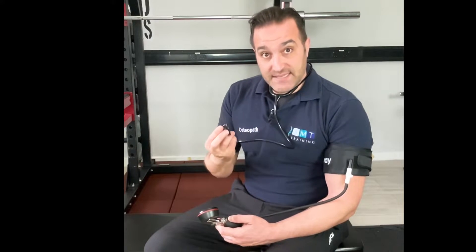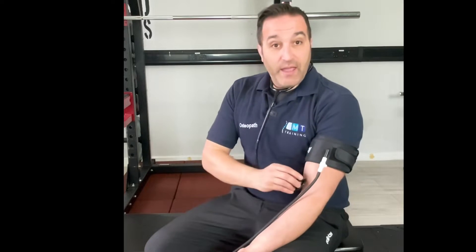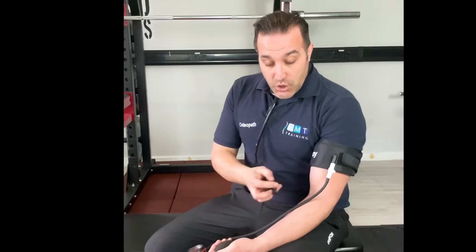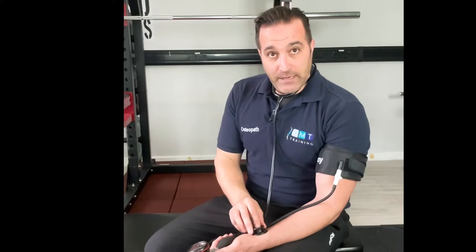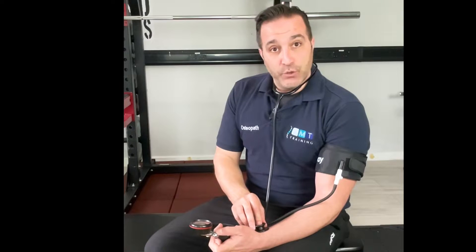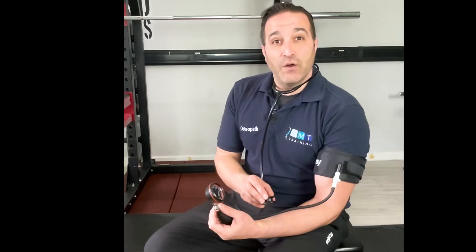We tend to use a stethoscope, and for the upper limb you will look for the radial pulse, but you could also do it at the brachial pulse as well. What you will do is increase the cuff pressure until you do not hear the pulse any longer. Then you release the valve until the pulse comes back and make a note of that measurement. For example, let's say the pressure was 150 millimetres of mercury when it reappeared on the stethoscope.